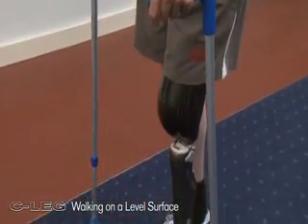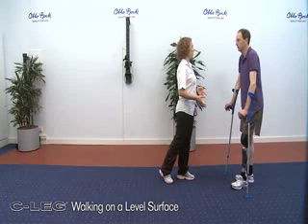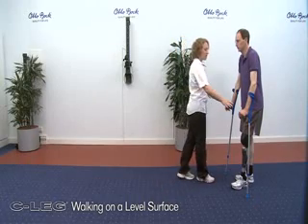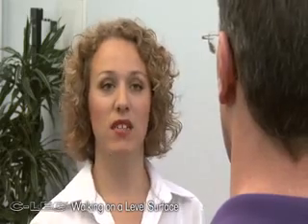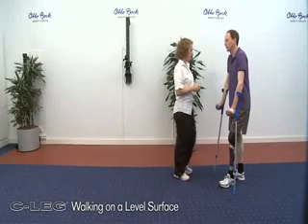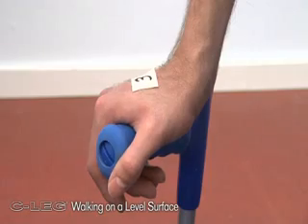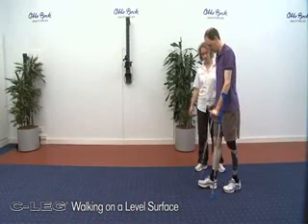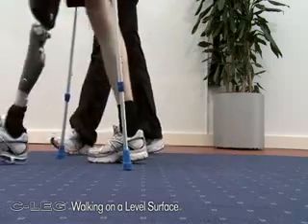Reducing the use of supporting devices is a major step towards achieving maximum independence for the prosthesis wearer. Learning the correct walking technique plays a key role in this process. Depending on the mobility grade, the patient should first learn the 4-point gait with assistive devices such as crutches, and then the 2-point gait with no support devices. Visual coordination aids can be very helpful for this.